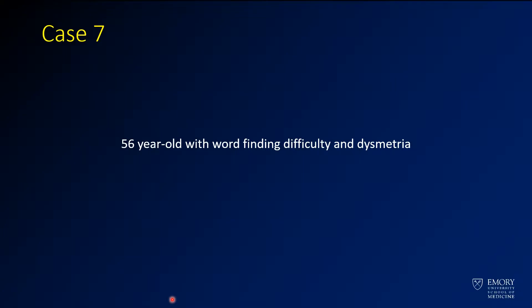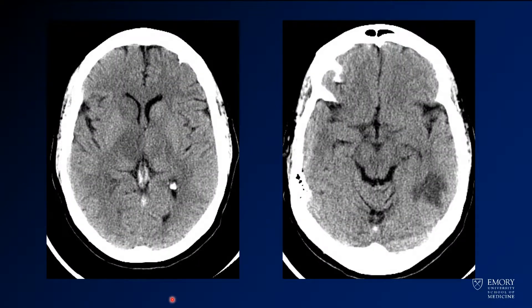The last case we'll go through here is a 56-year-old with word-finding difficulty and dysmetria. Here you have a couple of images from a head CT, with this area of hypodensity here.